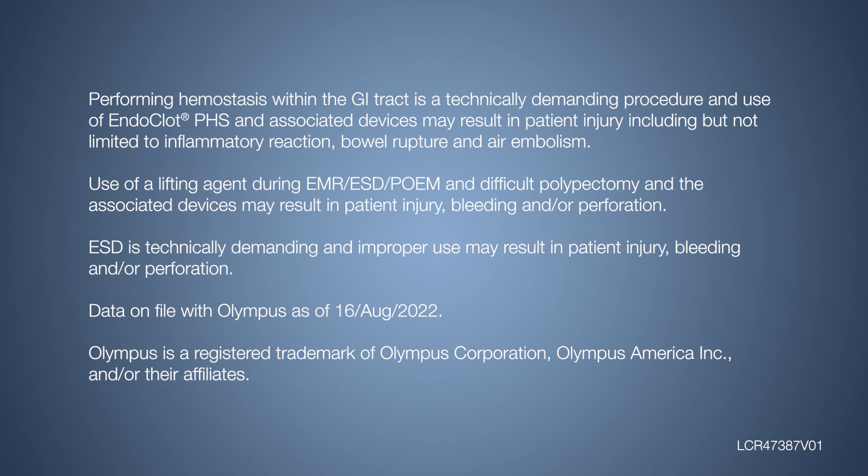Performing hemostasis within the GI tract is a technically demanding procedure, and use of EndoClot PHS and associated devices may result in patient injury, including but not limited to inflammatory reaction, bowel rupture, and air embolism.